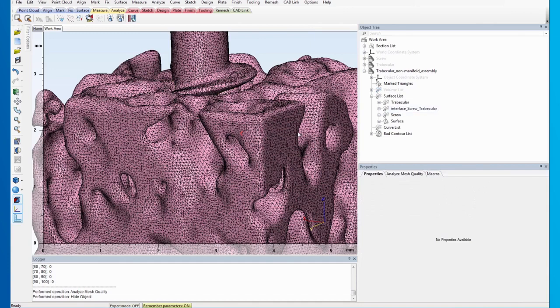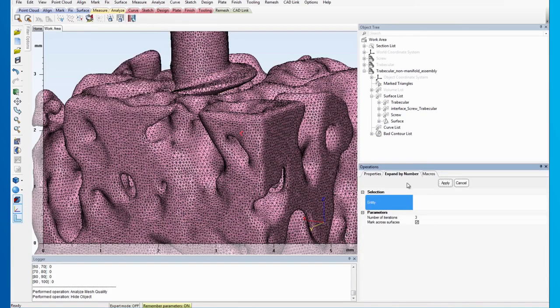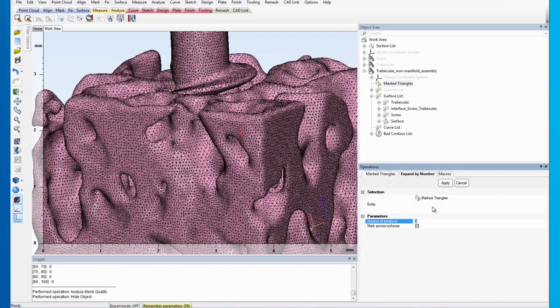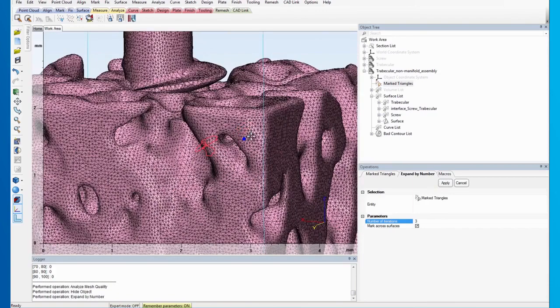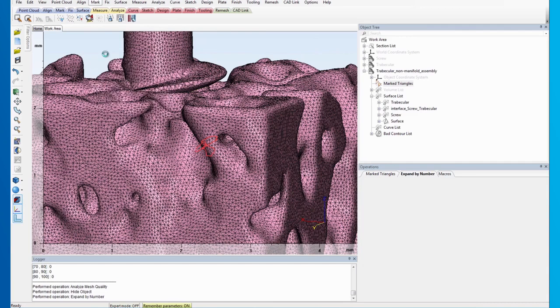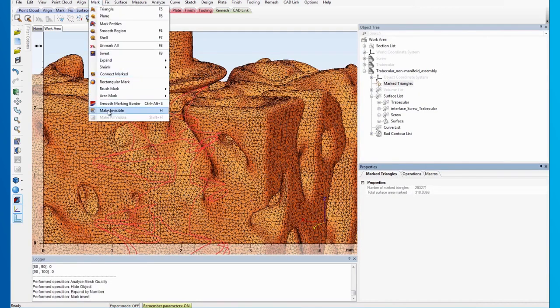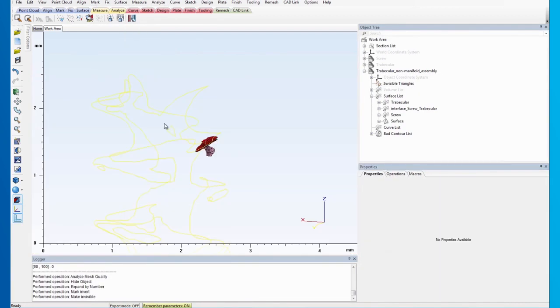In similar way to the previous step, we need to expand the marked triangles first, perform an invert marking and hide all the irrelevant triangles. To enable the triangles to be marked again, we will use Analyze Mesh Quality with the same parameters.